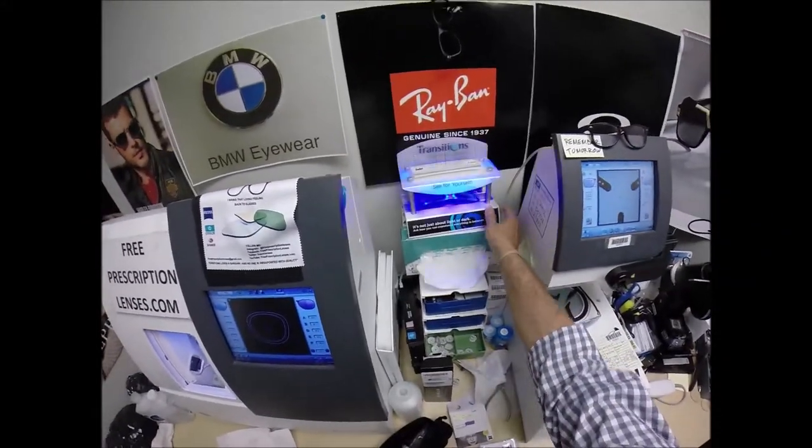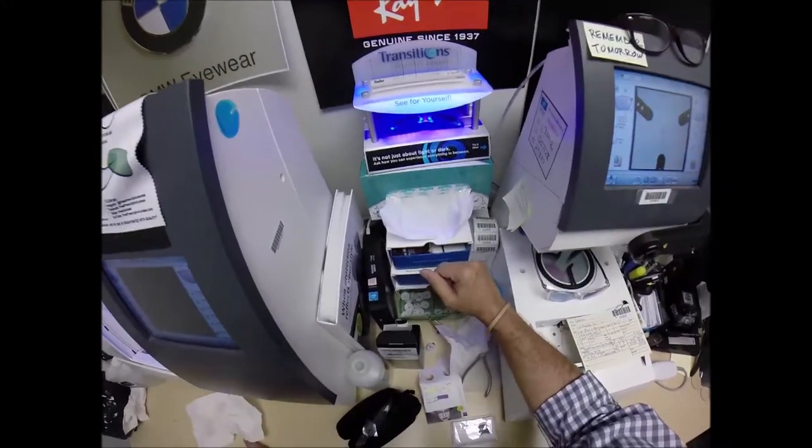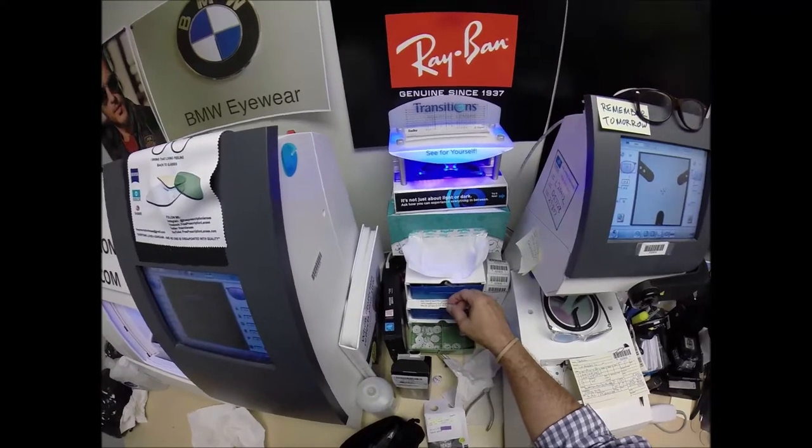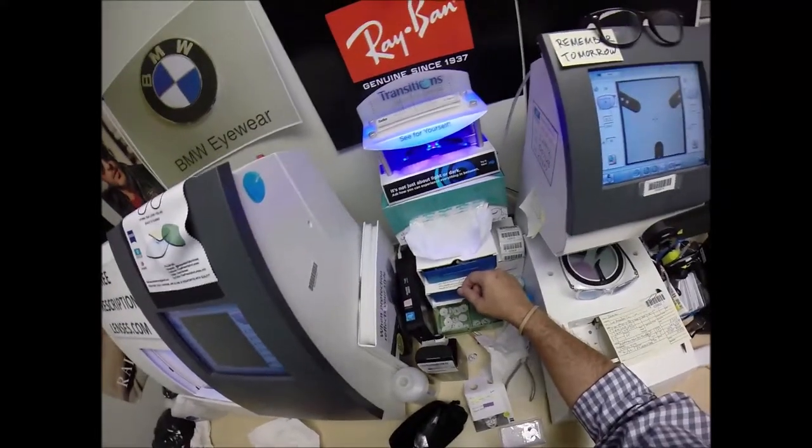Your windshield absorbs the sun's harmful ultraviolet rays that would cause your dashboard to crack from sitting in the sun all day, and that's why they don't turn dark in a car. Now, if you have a convertible or a motorcycle, they will darken.